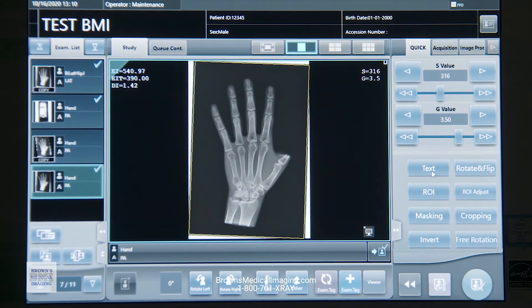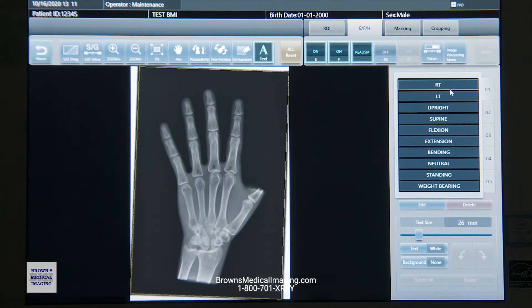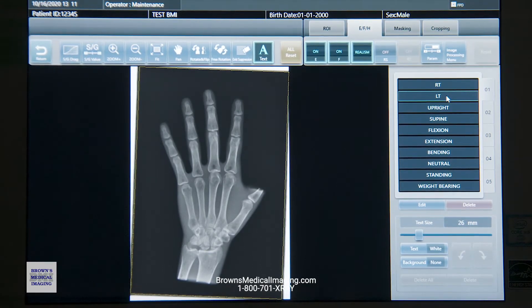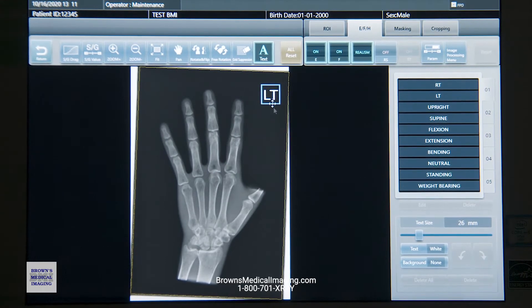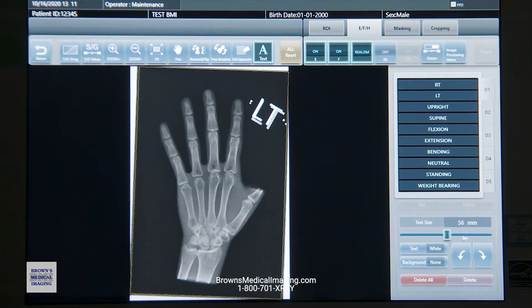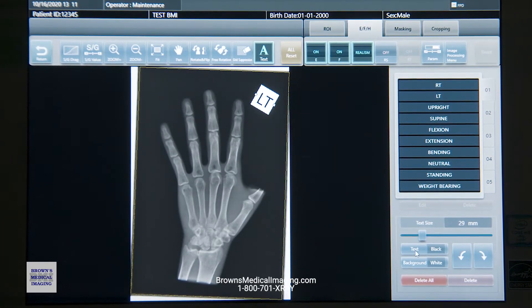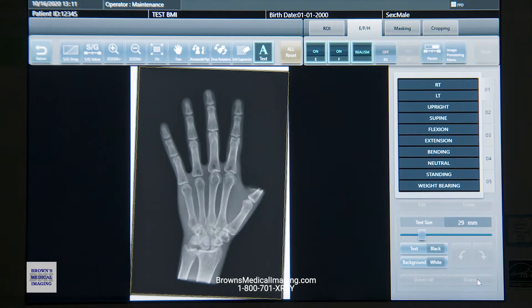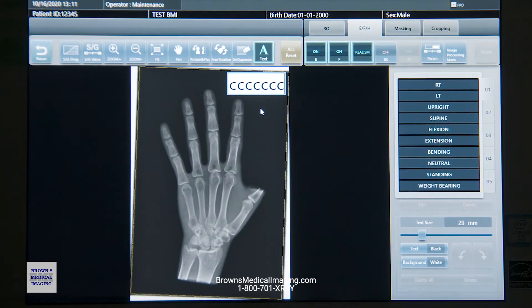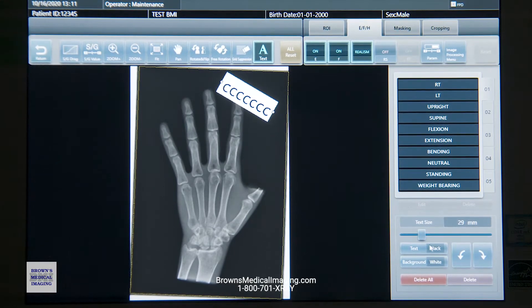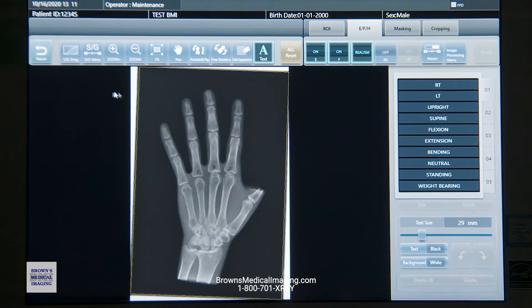Next set of tools down here — we've got text. We can grab from our pre-built set of annotations, select one, and just click on the image wherever you want it. If I highlight that, I can rotate it, enlarge it, make it small, put a background behind it, invert it, or delete it. We can also free text — just click on the image, type whatever you want, click off and it's there. You can do those same adjustments to free text as well.